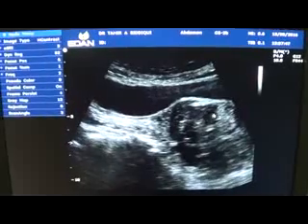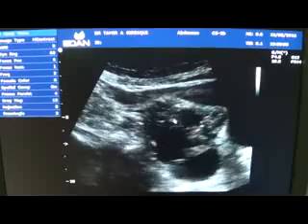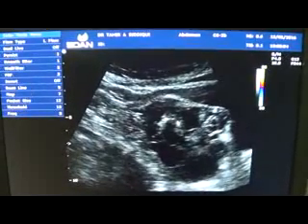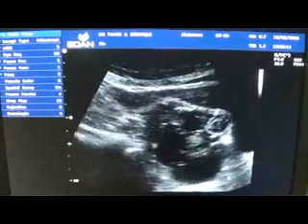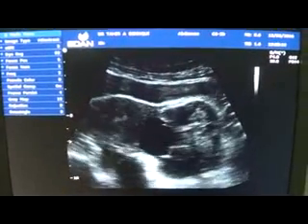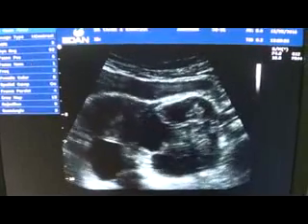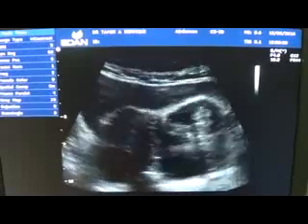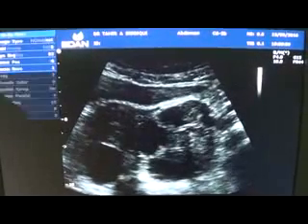The solid element contains tiny calcifications. These are two tiny calcifications within it, and a few additional calcifications are also seen. Separations are seen, and vascularity was demonstrated within this solid element. So this is a left ovarian mass of aggressive nature that needs further investigation. In summary, this is a cystic ovarian mass of the left ovary with solid vascular elements. Thank you very much.